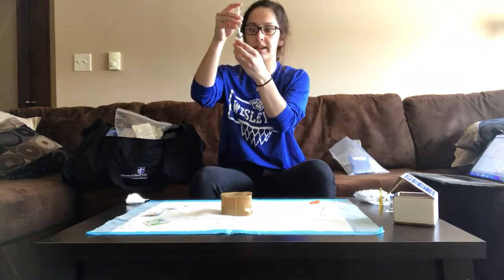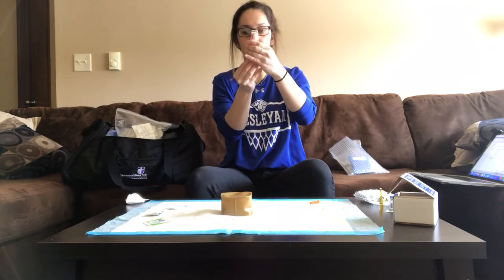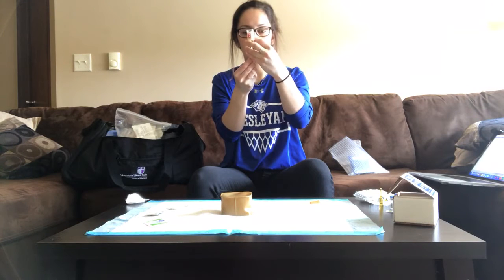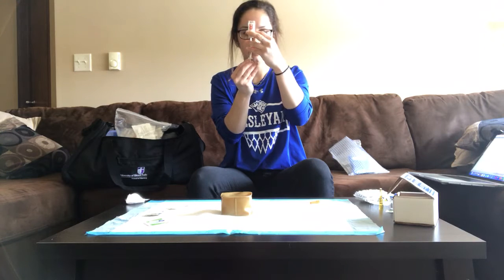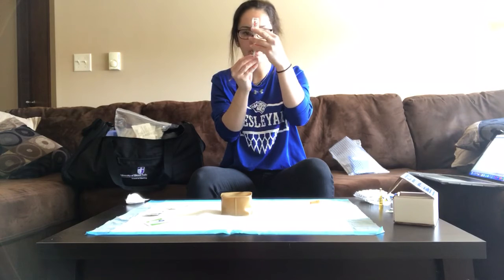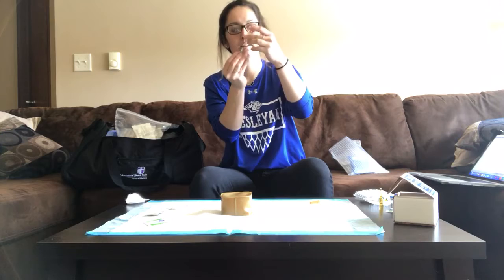Make sure that I'm in the air gap. I'm going to flip it over and make sure that my needle is in the liquid. And I'm going to draw 9 units of this insulin. Make sure there's no air bubbles. Make sure that I am on 9.